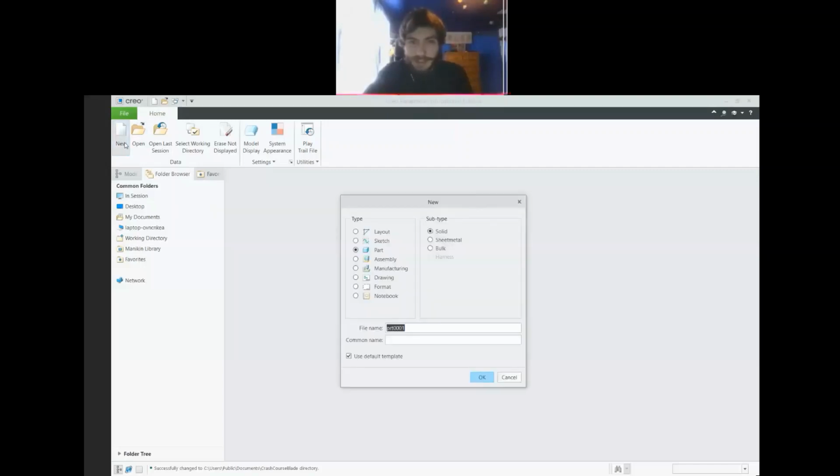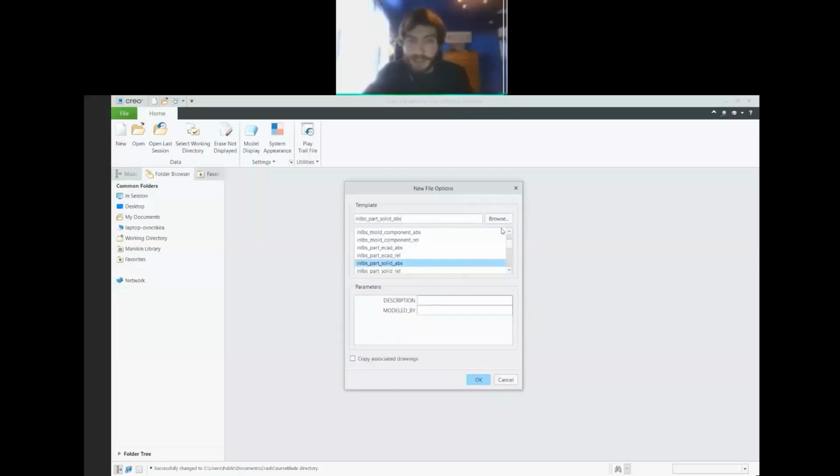So then we're going to go ahead and create a new part. Since we're going to deal with a 3D part, we'll make sure it's a solid part file. So part, solid. We'll name it the blade. We're going to uncheck the default template just so you can see what's on the next screen when I press OK. Basically here is where you pick your unit system. By default, it's in inch pounds for solid parts. If we wanted to change to metric, we could go down to millimeter Newton second for solid parts, but we can stick to inches just because it's what everyone knows from here. We press OK.